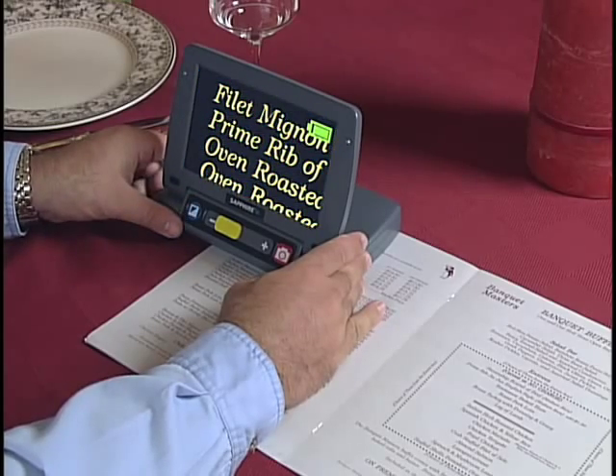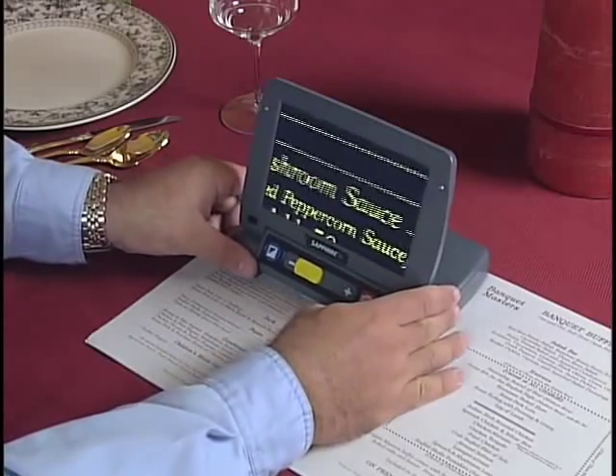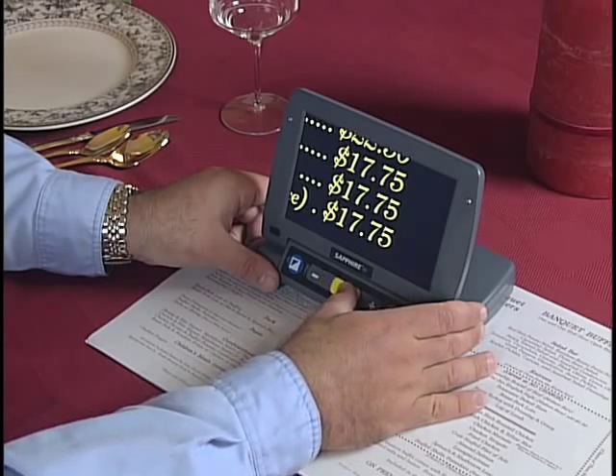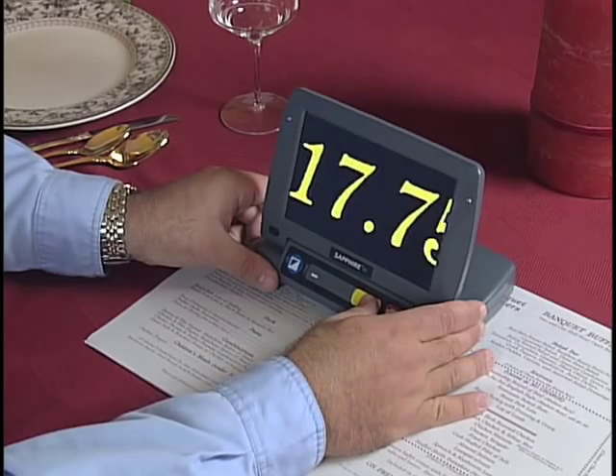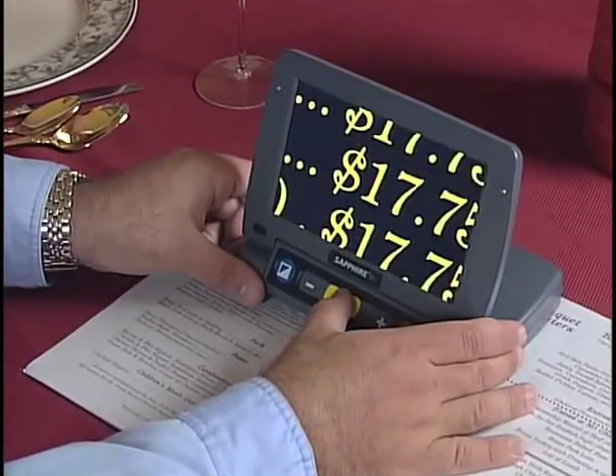Press the blue button to select full color or one of the Sapphire's high contrast enhanced video modes for the most comfortable reading in any surrounding. And use the yellow slider to adjust the magnification from 3.4 times all the way up to 16 times, or to any level in between.